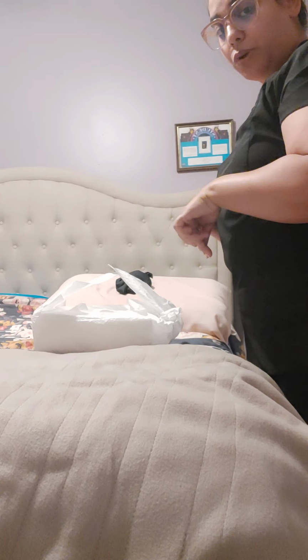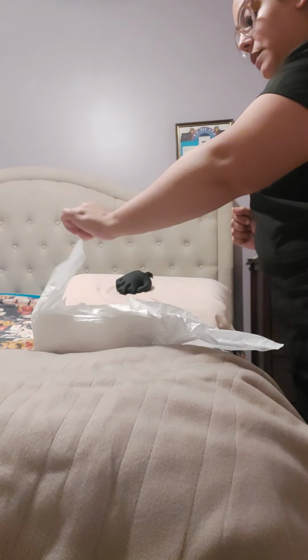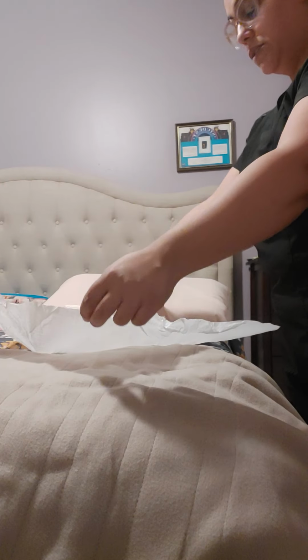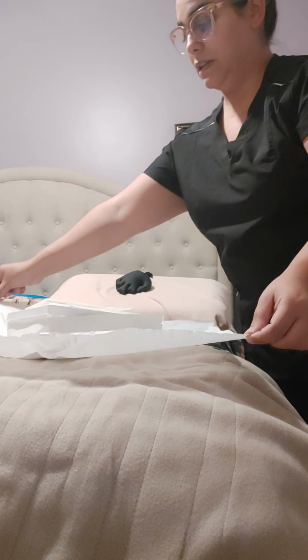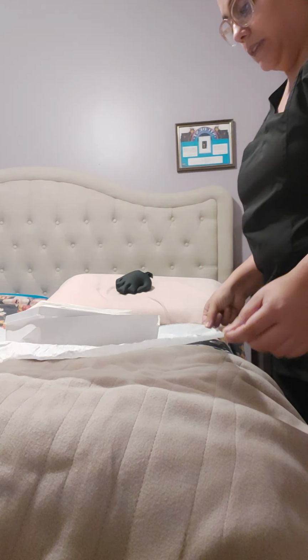I have a 1-inch border that I can touch, so towards me, away from me, outwards. And I like to use my 1-inch border to kind of just move this around and position it where I need it.